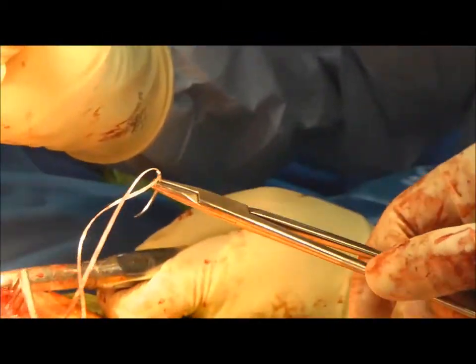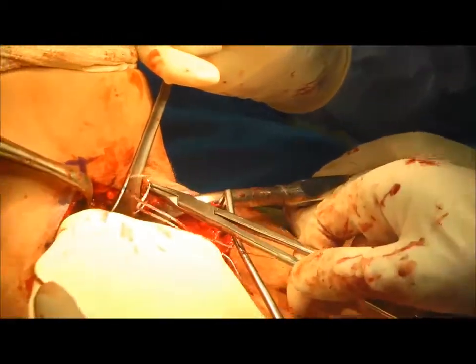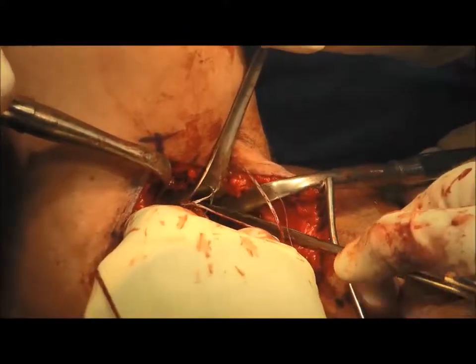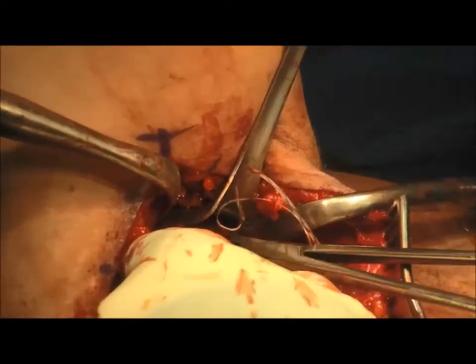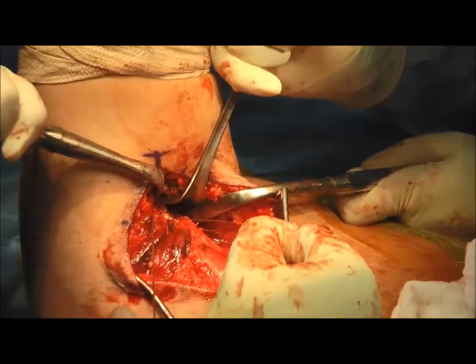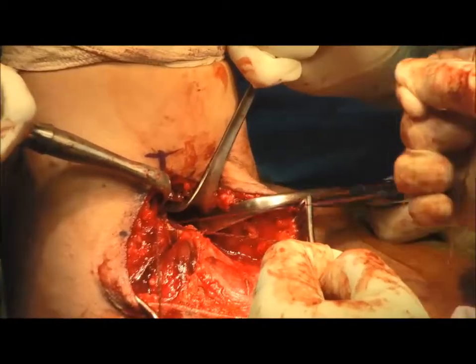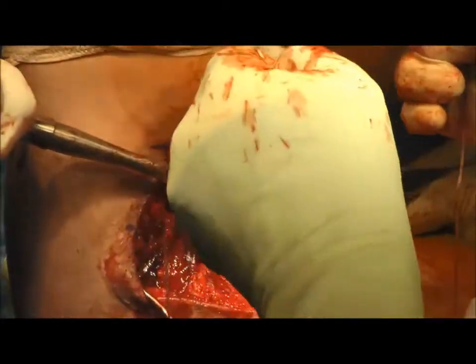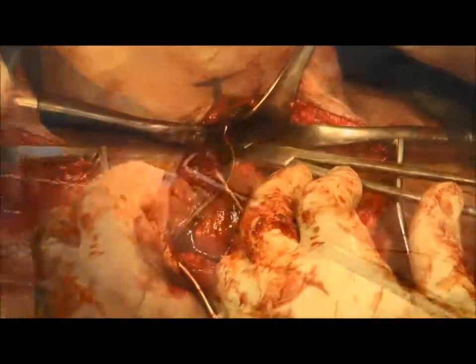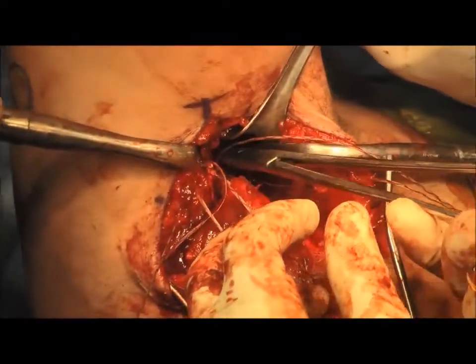Next, a free needle is used to pass one limb of each of the suture tapes from deep to superficial through the tendon. This allows for the knot to be tied on the superficial surface of the tendon after it is reduced to its footprint. This limb will also serve as the post-limb for knot-tying. One limb of the other set of suture tape is also passed through the tendon in the same manner.